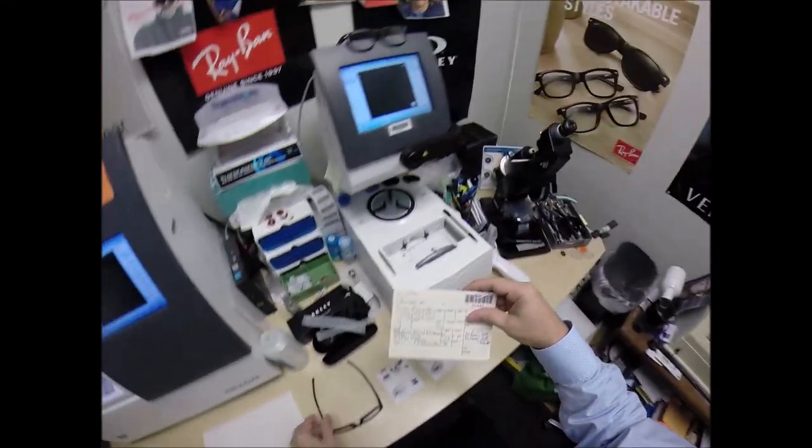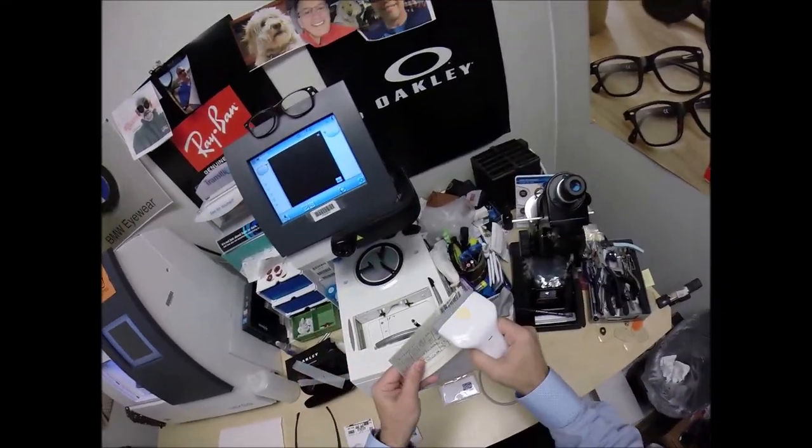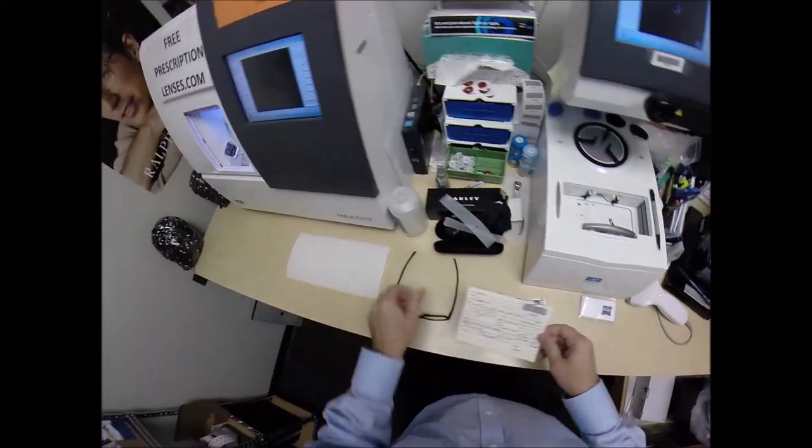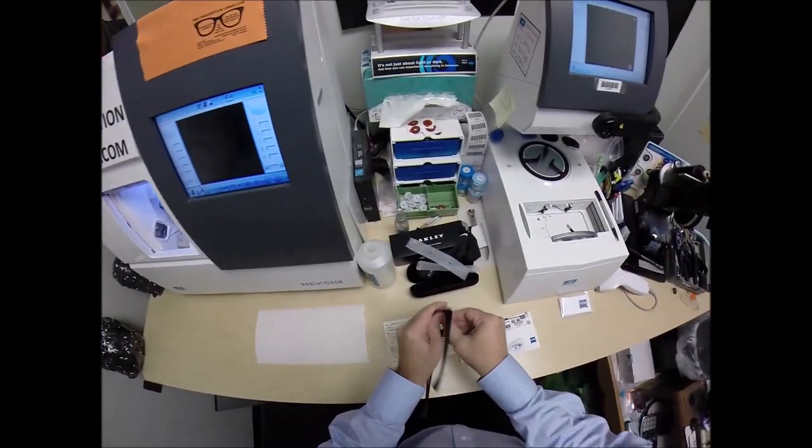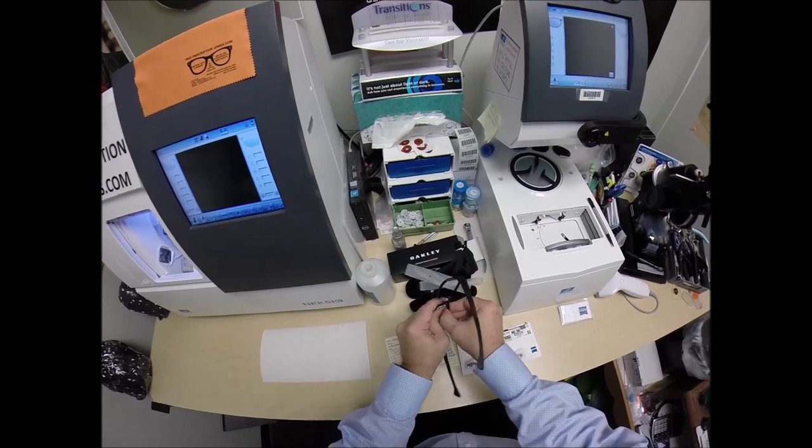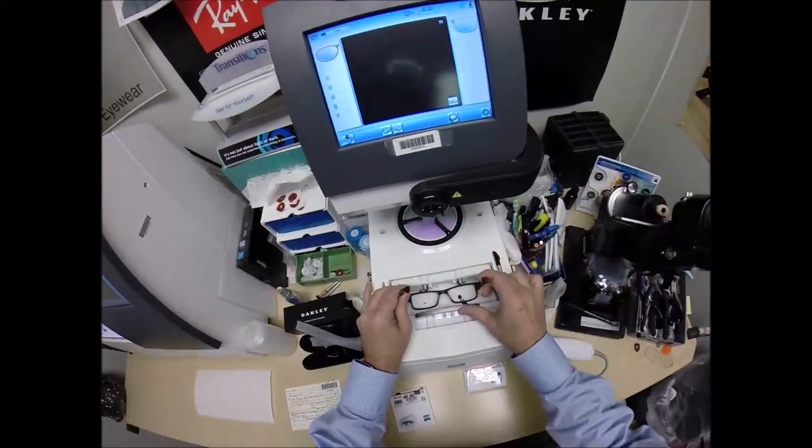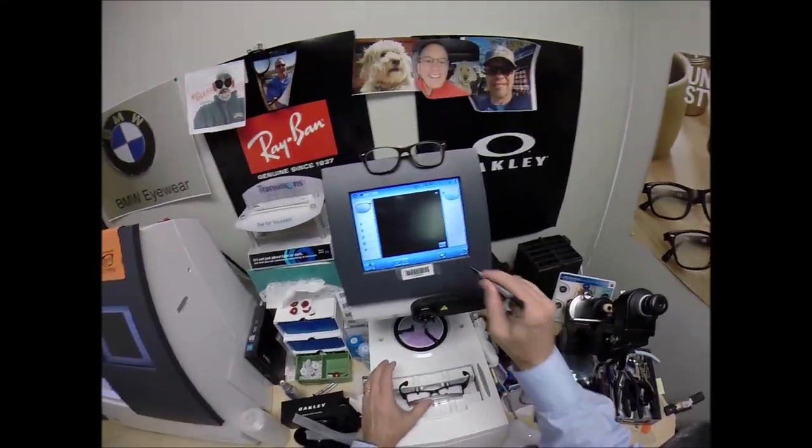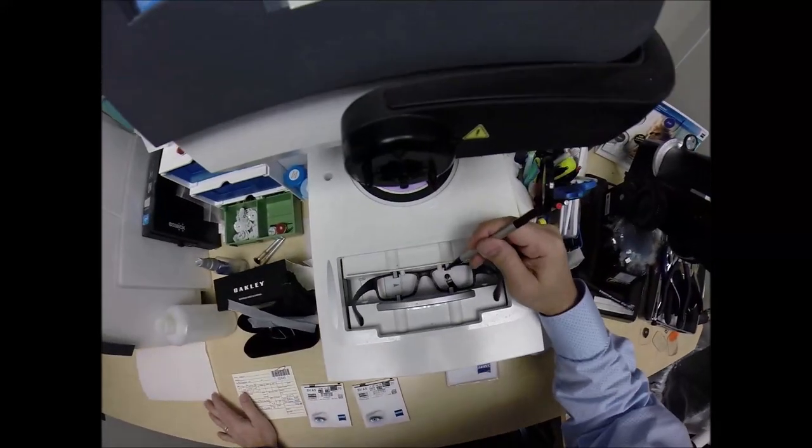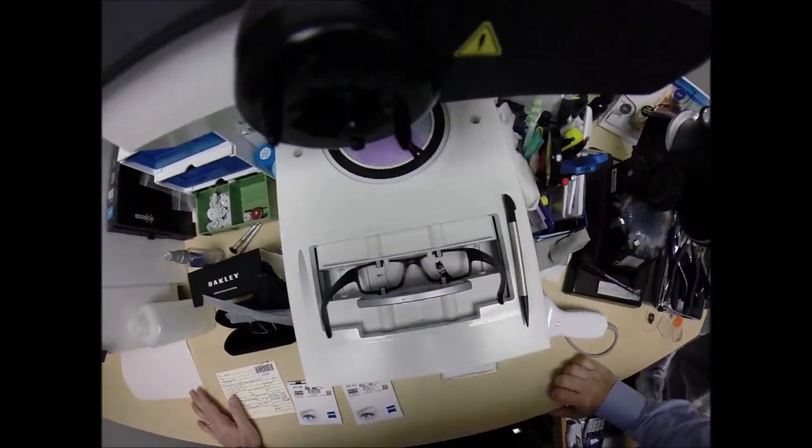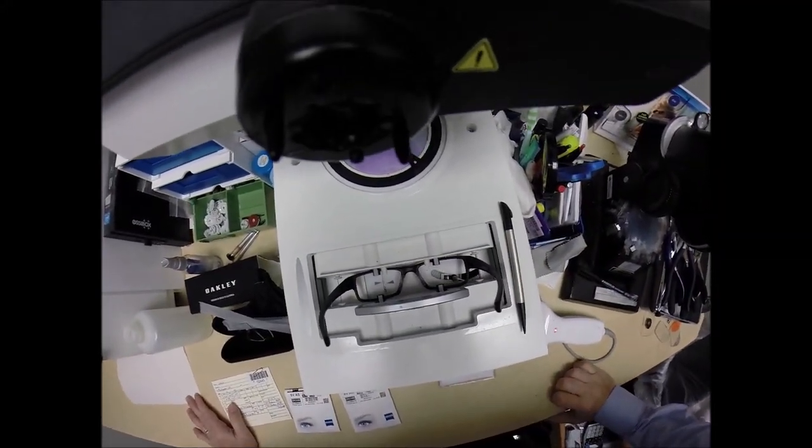I'm going to go ahead and program this shape into the computer. You are Secret Agent 2445. Pop out the original demo lenses, of which you will receive everything. Put your frame into the tracing element of my blocker and hit start. A little stylus is going to pop up, go around, trace the inside bevel of the right side of the frame before doing the same thing on the left.